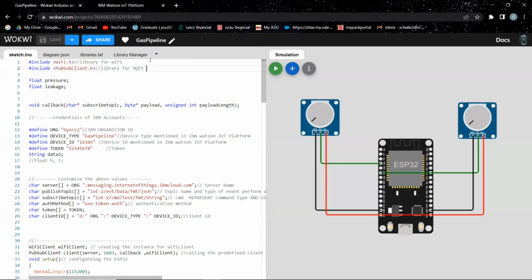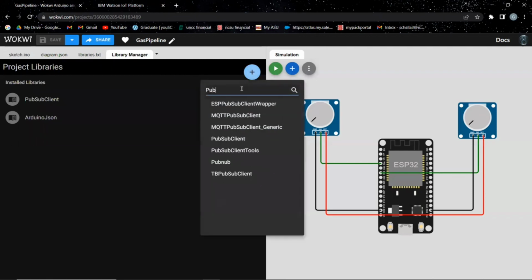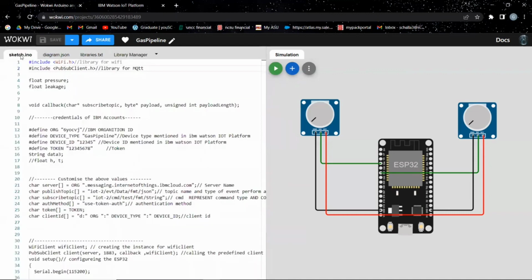Apart from mentioning the libraries in the code, we also have to add them manually in the library manager pane. So go to the library manager and then click on the plus symbol to search for the libraries and type out the library name. You will have to select the name that appears in the drop-down menu and it will be added automatically. Here we also use the extra Arduino JSON library, which enables us to connect with the Node-RED interface.